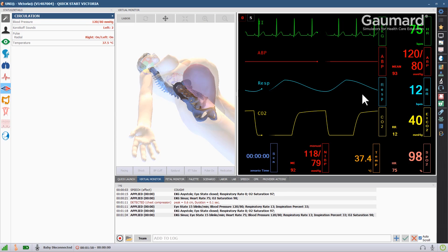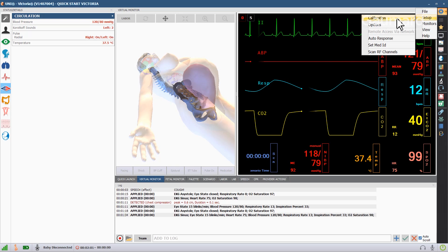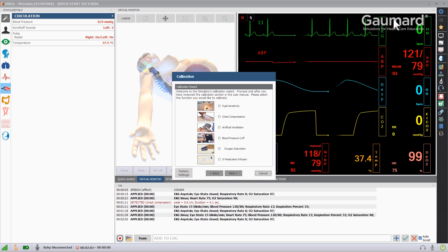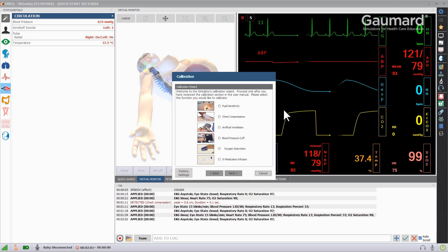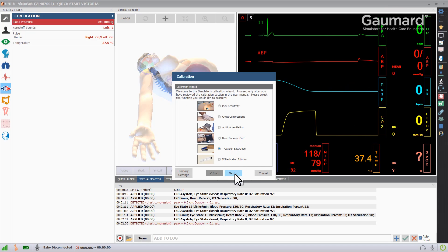To begin the calibration process, click the menu icon in the upper right. Scroll over Setup and click Calibration. Click Oxygen Saturation and click Next.